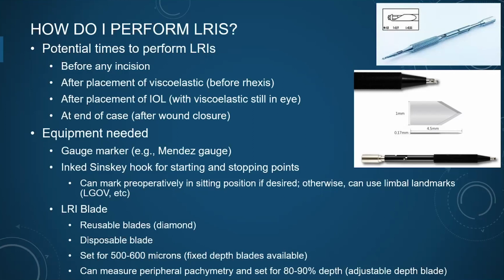As far as the LRI blades, there are a lot of options. My preference would be a reusable diamond blade, and we're fortunate enough to have those at our facilities. But I do sympathize that the finances with diamond blades are not an easy pill to swallow.